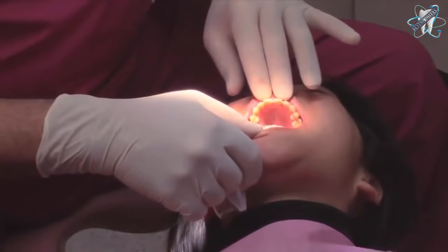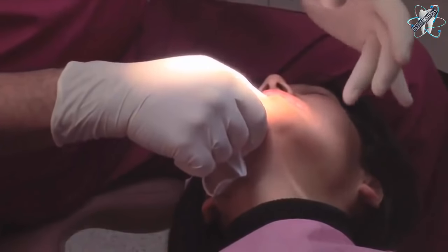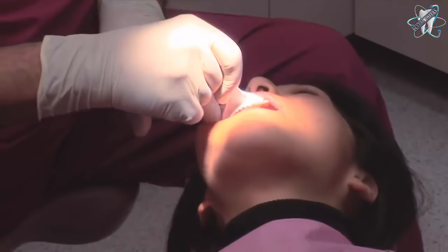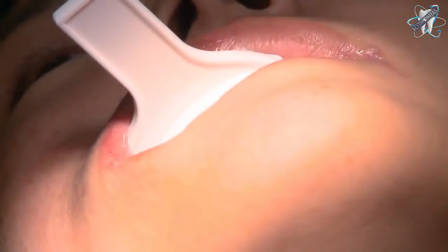While waiting for tissues to retract, instruct the patient how to properly close in centric occlusion for taking a closed bite impression. Repeat this with the closed bite tray. Notice how the patient is properly closing in centric occlusion.